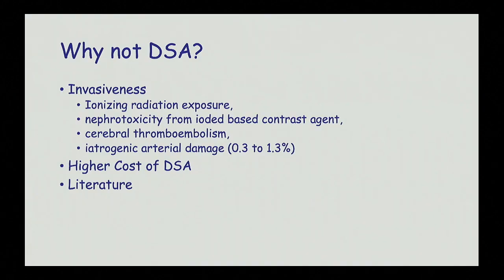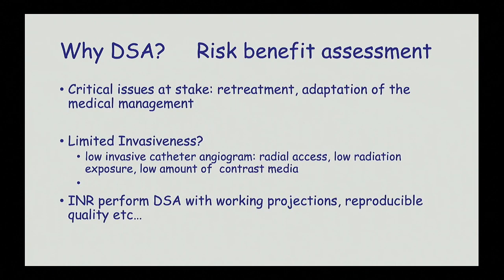So why not perform DSA? Because some people will say that DSA is too invasive because you use radiation exposure. We have nephrotoxicity from contrast media. We may have complications from angio, but overall it's not so bad, I would say. If you are afraid of all this, we can decrease the invasiveness of the DSA.